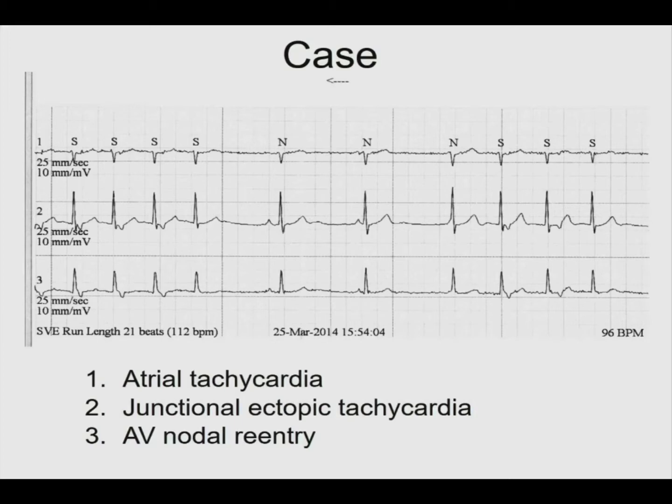The first step before we talk about what happens in the EP lab is to look at the electrocardiograms. And I'm realizing this is increasingly a challenge. We have Epic as our EMR. You can go through Care Everywhere and read all the reports, but one thing you can't look at are the EKGs, of course. It's like going to see an orthopedic surgeon with all your records, but not the x-ray. So make sure you get the primary data, and you will start to realize how important that is when you get patients referred to you with AFib that don't have AFib once you find the tracing, or VF that's artifact. So look at the tracings.